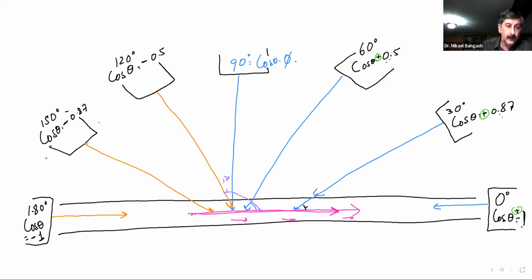So what was all this about? It was saying that the angle between the direction of the blood flow and the sound beam has its own cosine theta values, and it was those cosine theta values that we put into the equations.